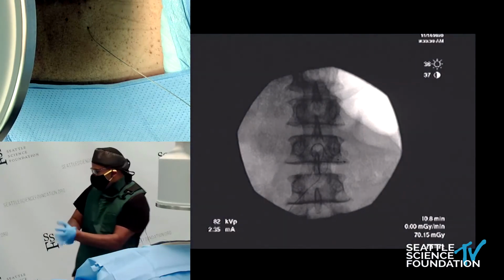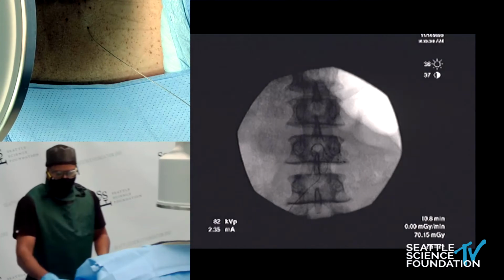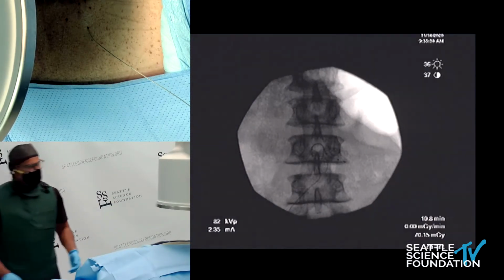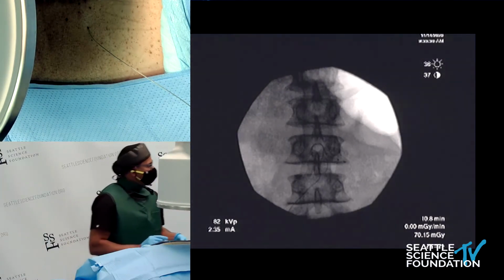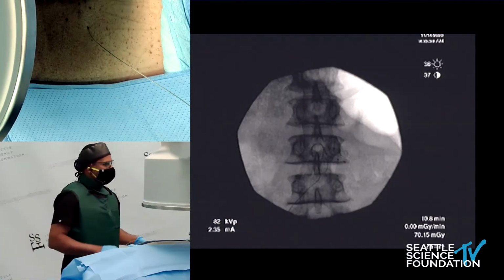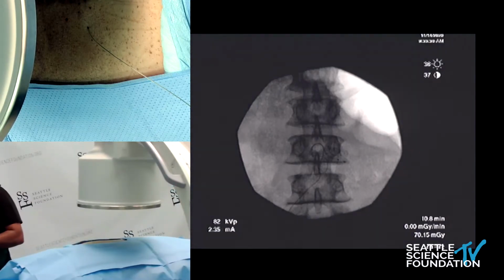And then, Lindsay, we've got a little template here. So we'll just use this IPG, but really, what I'm going to show you is applicable to really any of the systems here. Great. So as I mentioned, I think it's really important to mark out everything when you're placing your leads, but certainly when it comes to the IPG, I tend to follow Langer's lines.